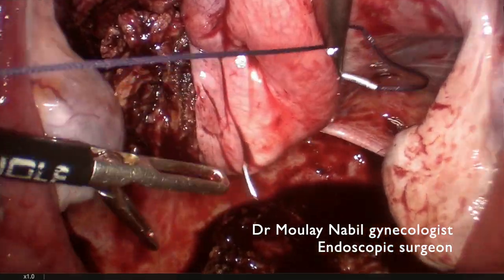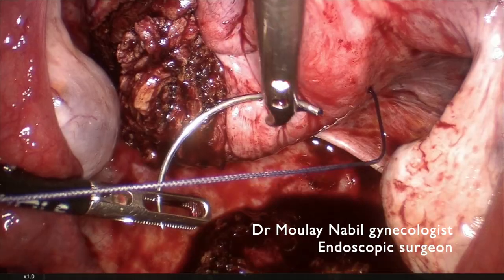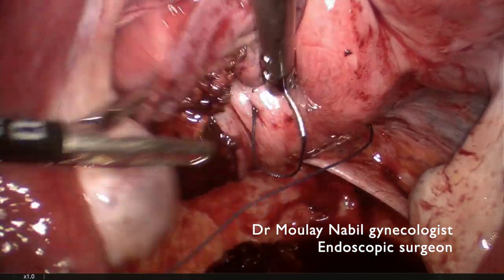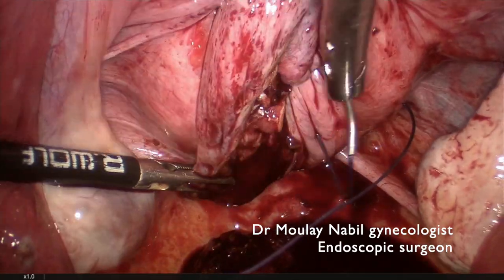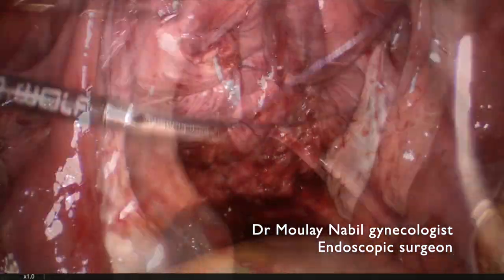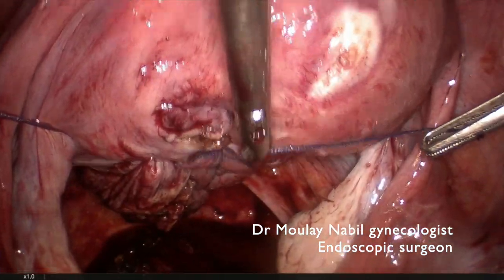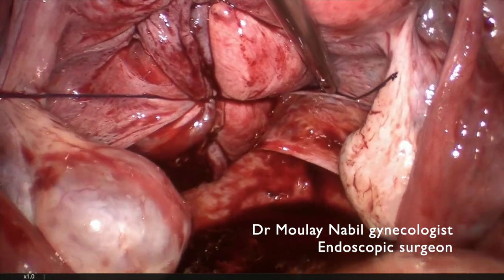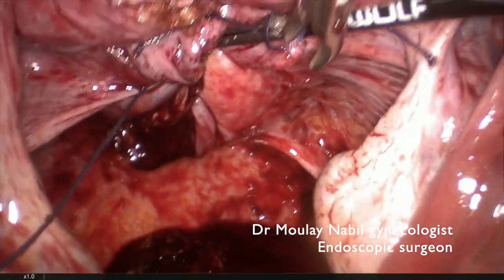For this 10 cm myoma, four or five knots are sufficient. We place another knot one centimeter below the previous one and two to three centimeters outside. We place the stitch deep in the myoma bed. At this level, take care not to incorporate the ureter in your stitch — it can sometimes be closer than we think. We prefer interrupted suture over running suture; in my opinion we have better hemostasis with this technique. We tie the double flat knot until there is a blanching as you see, and we invaginate the tissue. We do not use bipolar coagulation for hemostasis — stitches are the only means used.